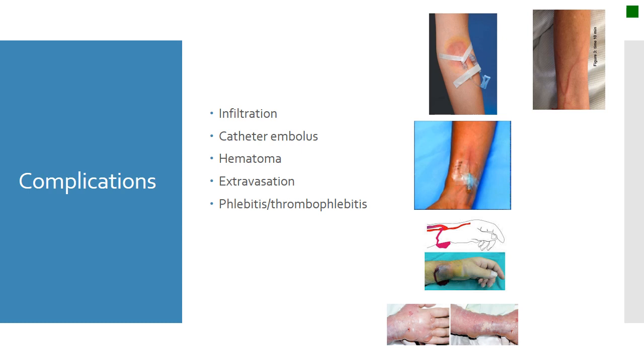So you need to discontinue the infusion or remove the catheter because it is now dirty. It is a dirty needle catheter. Elevate the extremity, apply a cold compress at first to minimize the blood flow to the area, and then a warm compress later to improve the circulation after you have begun treatment of the infection.